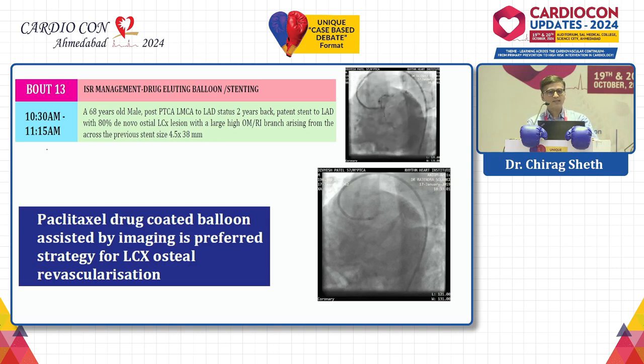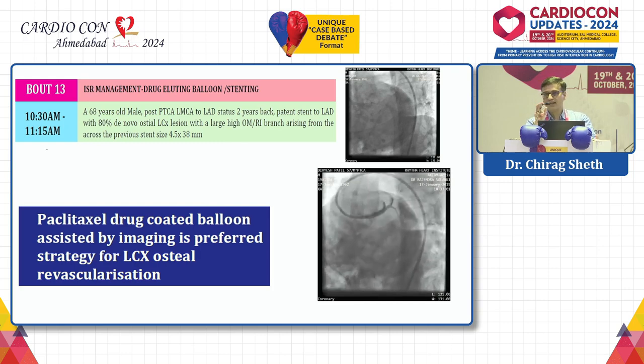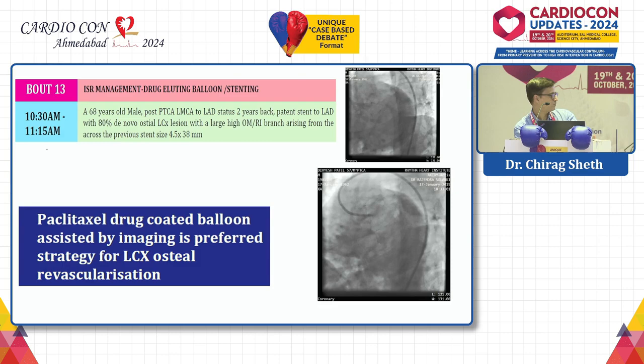And therefore, this is a patient which I treated in year 2019 with the help of stents. But given a chance, if I have this anatomy to treat today, given the evidence with registry data and the paclitaxel-coated balloon technology, I would consider that as a valid option as of today. Thank you.